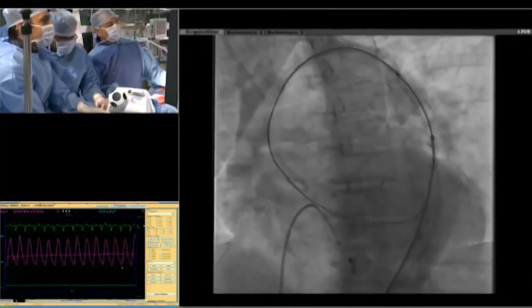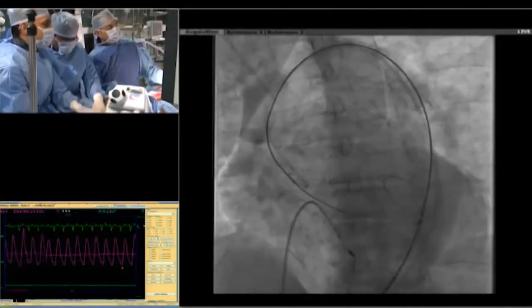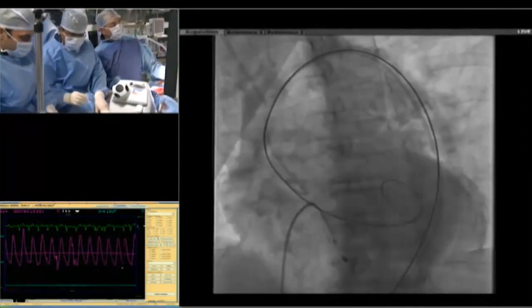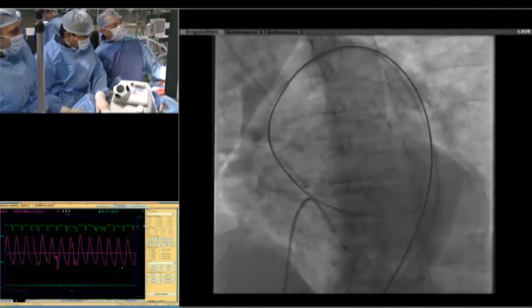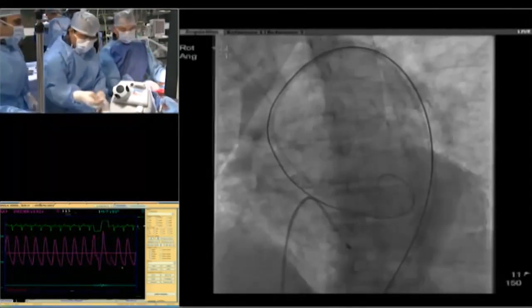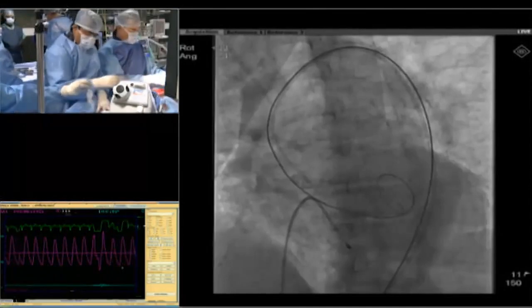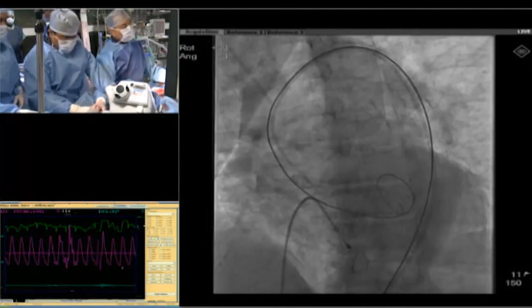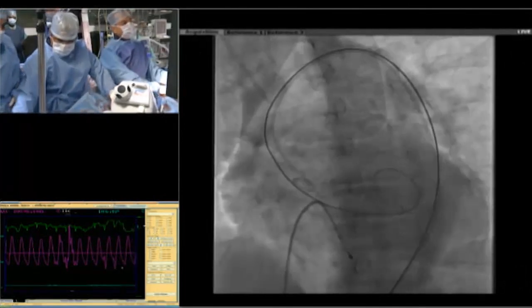So we did that pre-dilatation, and now we're going to put in our 22 French sheath. Almost out. Okay. Let's get the balloon out. Go to 48 mag now. Show us the wire in the LV, and we would like to see the sheath as it goes up. Less mag now. You can come to AP if you want. We'll go back to that coplanar.